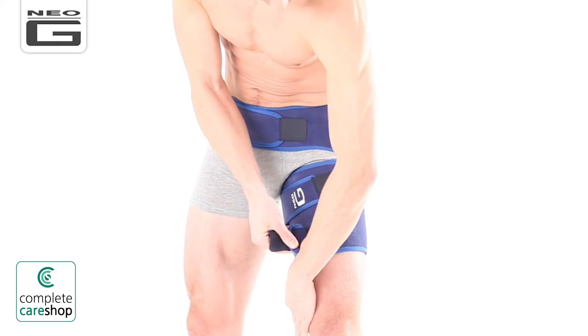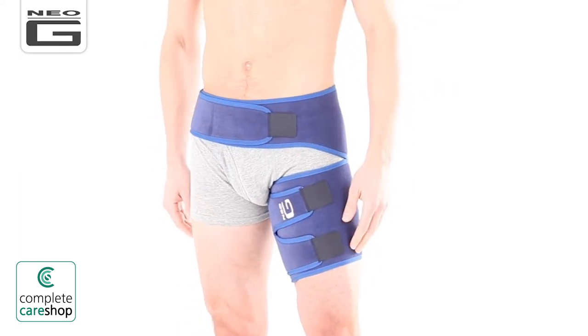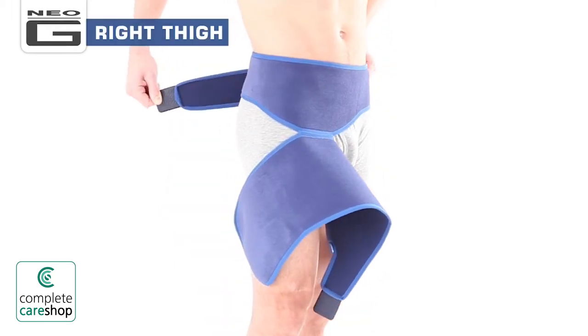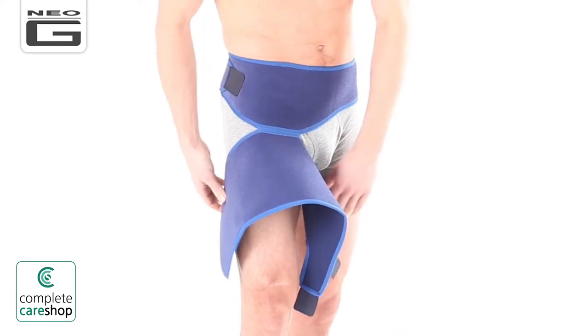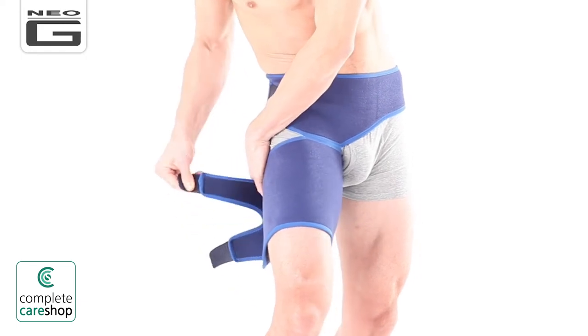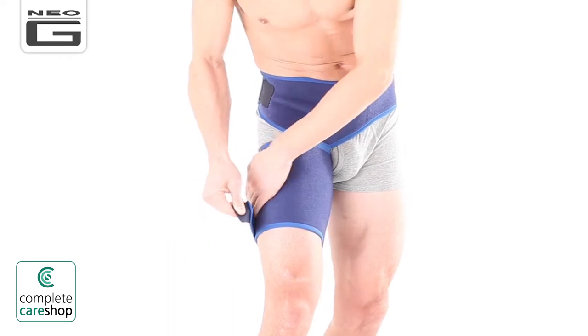Whilst holding down part of the lower flap, bring the flap area with the two fasteners around your thigh and secure both fasteners. Adjust until firm but comfortable. As demonstrated, if fitting the left thigh, the three small fasteners will likely be fastened towards your front. If fitting the right thigh, the three small fasteners will likely be fastened towards your back and side.